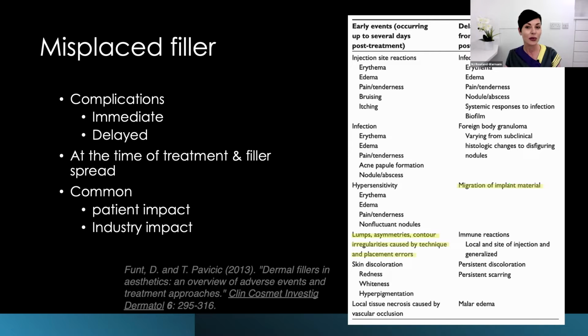So I've chosen 2 misplaced filler cases today simply because this complication is ubiquitous. You will see it daily. And with your Clarius, you have the ability to bring about a swift and effective resolution. I know there are bigger and scarier complications out there, the occlusions or infections, but I wanted to give you something in this webinar that you can tackle very soon after starting out with ultrasound, identifying and eliminating the most common problem. That way, you can build your skills and work towards the more challenging problems that will undoubtedly come your way.